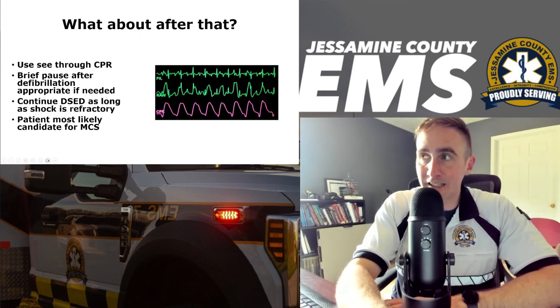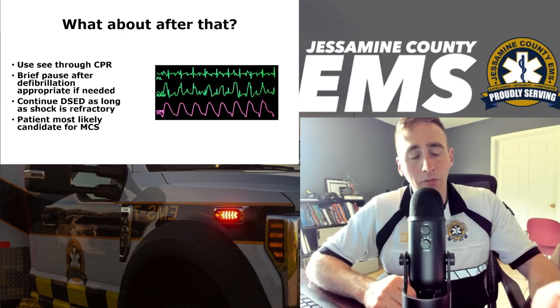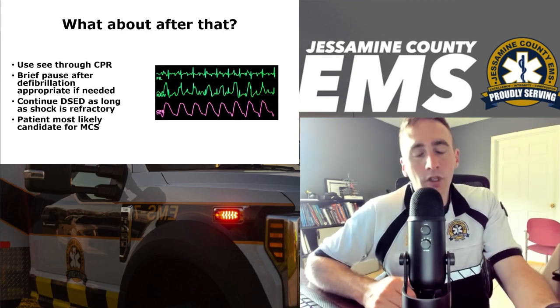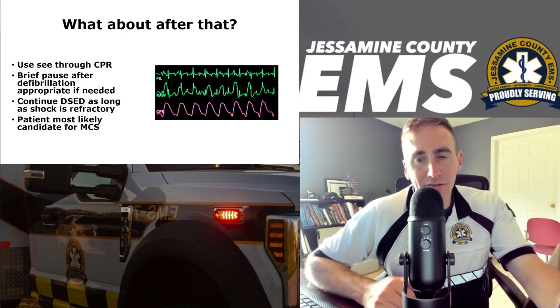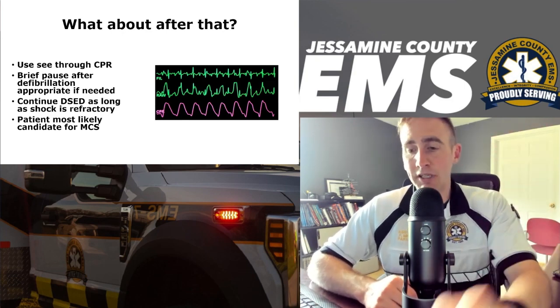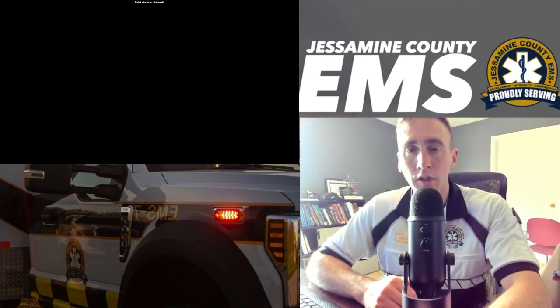rhythm is clean enough to be able to determine if that shock's been effective or not, because I'm only going to continue dual sequential if the patient is refractory. So continue dual sequential as long as the shock is refractory, and this patient is most likely a candidate for mechanical circulatory support.